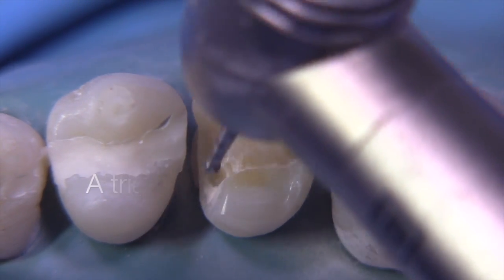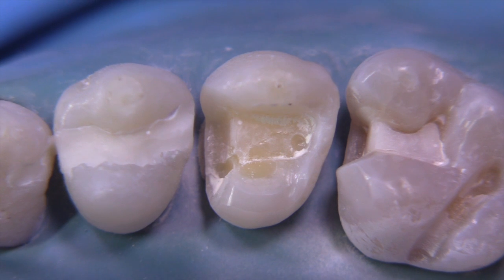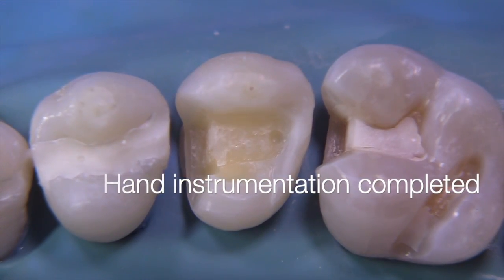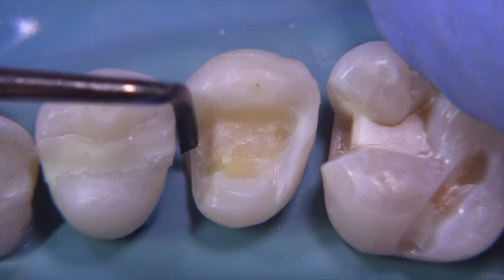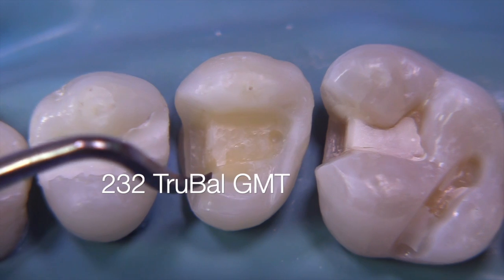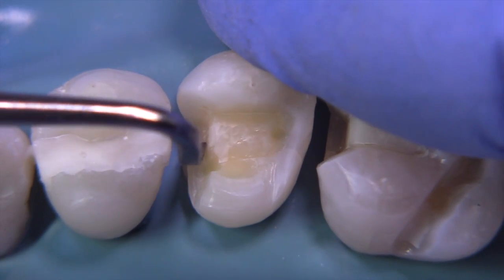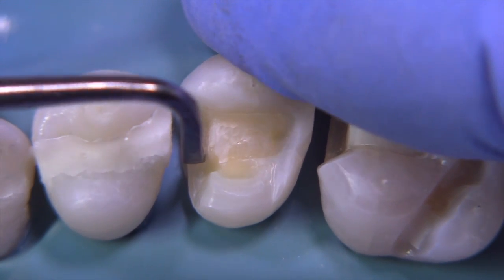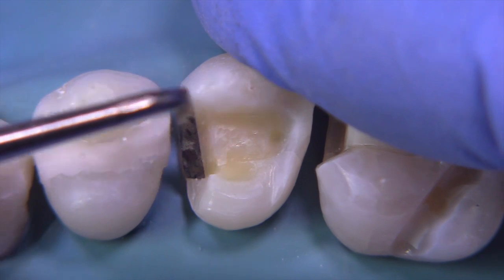Now we have a triangle of resistance form: the pinhole on the occlusal, the pinhole on the gingival, and the wall on the facial. We've completed our hand instrumentation except for the internal bevel of this particular case. This internal acuteness is something I haven't shown you yet. I'm just going over that gingival bevel a little bit with the gingival margin trimmer. Here's the internal acuteness we're talking about — with the 232 TrueBow gingival margin trimmer, we make about a 30-degree internal slope to the gingival wall. This is going to help increase the resistance form and also aid in seating this inlay and driving it into the tooth properly.